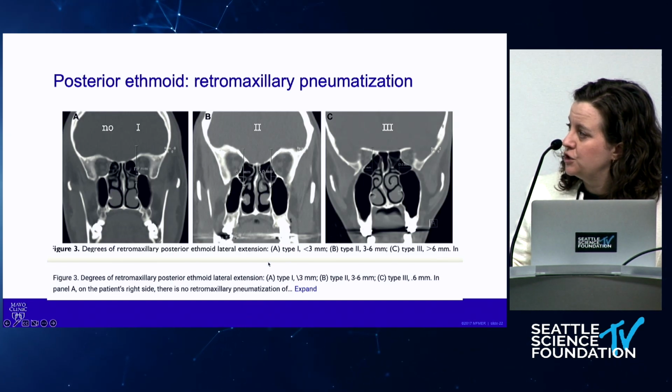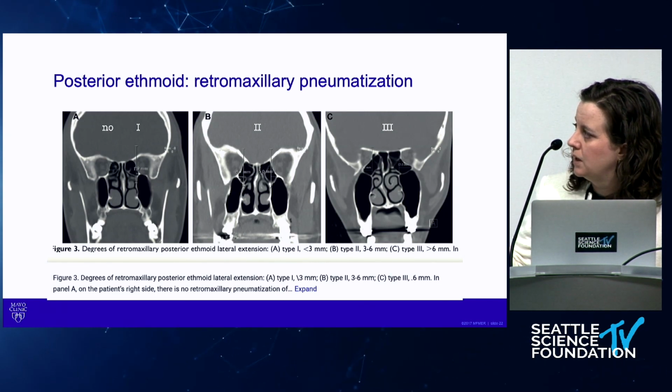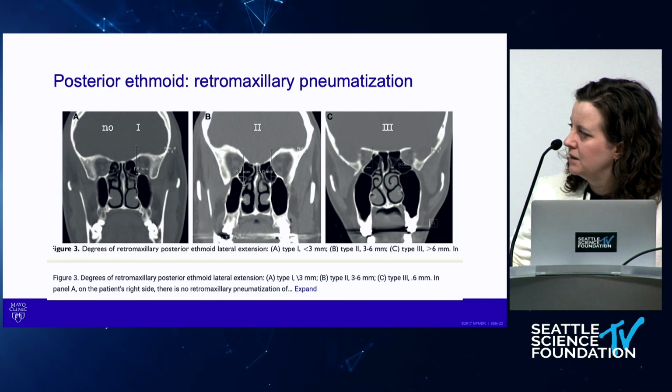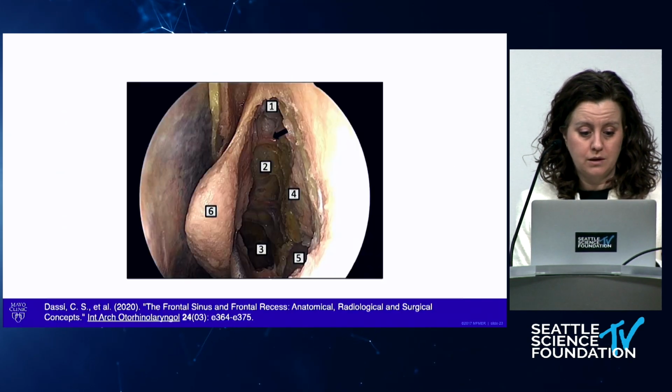It can be pretty much a straight, smooth lamina, but it can extend way back over the maxillary sinus. You want to make sure that when you're doing your posterior ethmoidectomy, you get those completely open, because I do see a lot of disease inferior here where the bottom of these posterior cells aren't completely opened and stuff accumulates there. So make sure this whole posterior wall, posterior ethmoid wall is taken down.